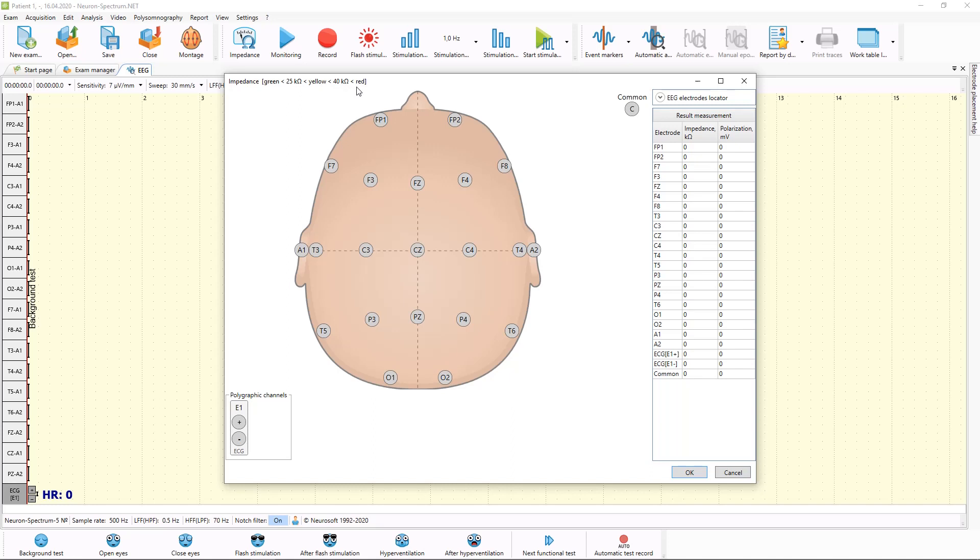Now I have no device connected to my PC. I am working in emulation mode. That's why I will not see any impedance results. But with real device, you will see green, yellow or red color on all electrodes. The task of nurse to put electrodes carefully to make all impedance in green area.